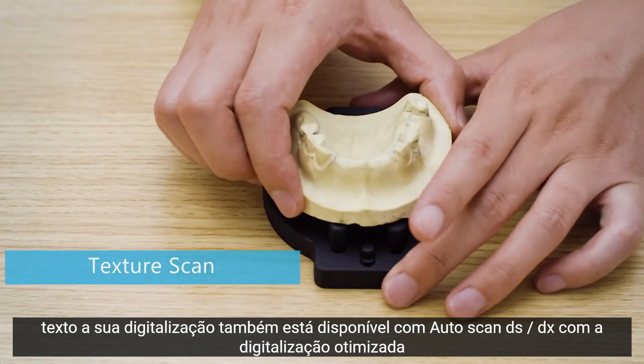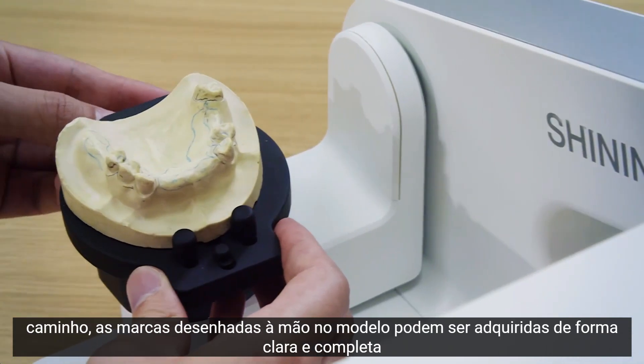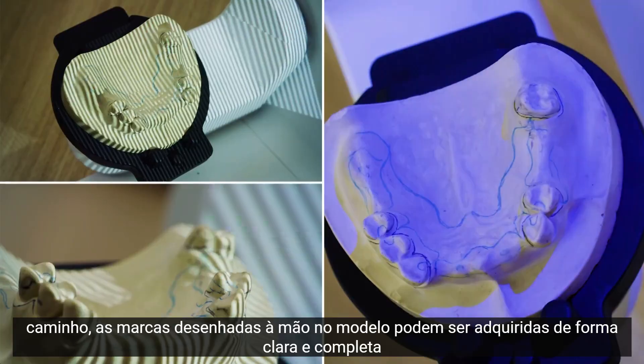Texture scan is also available with Autoscan DS-EX. With the optimized scan path, the hand-drawn marks on the model can be clearly and fully acquired.